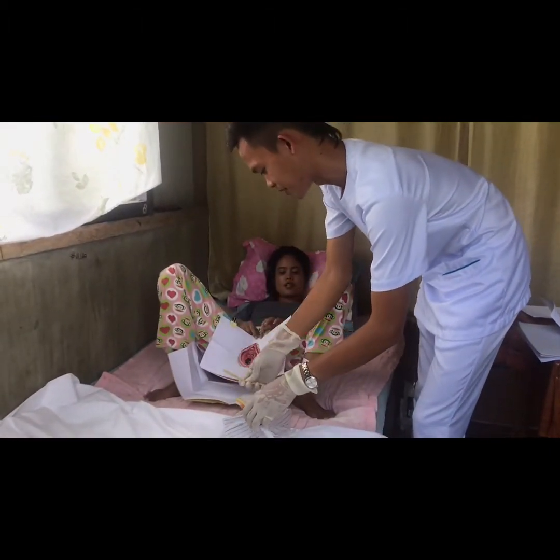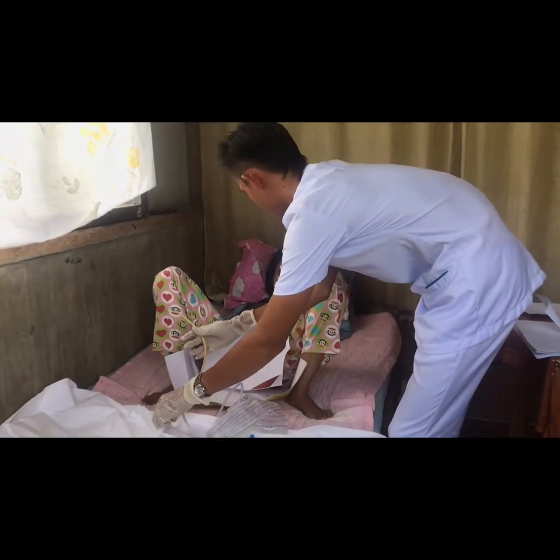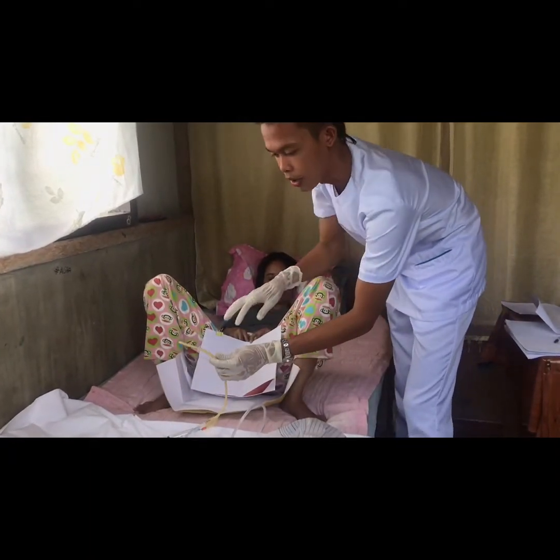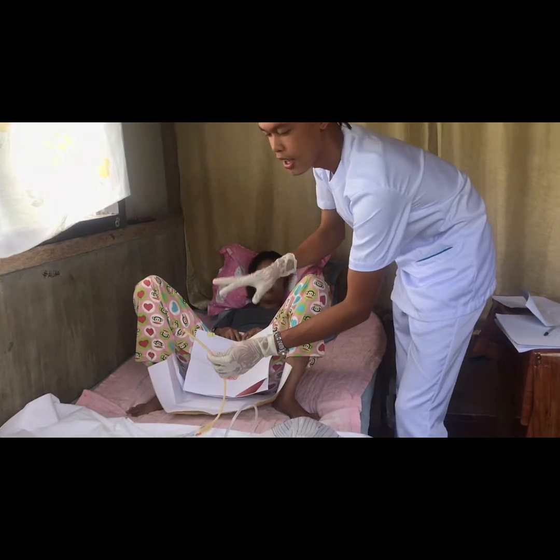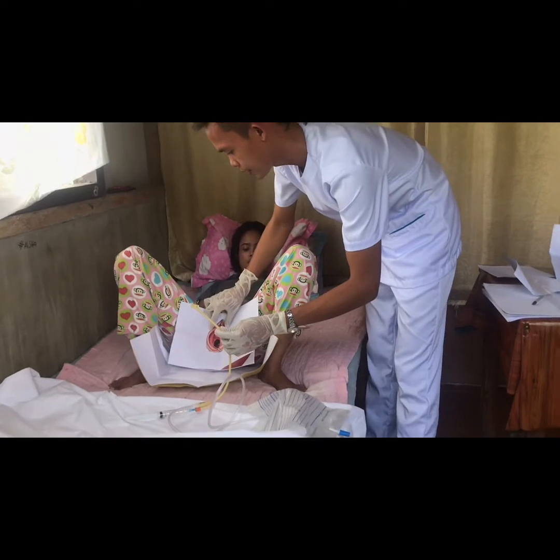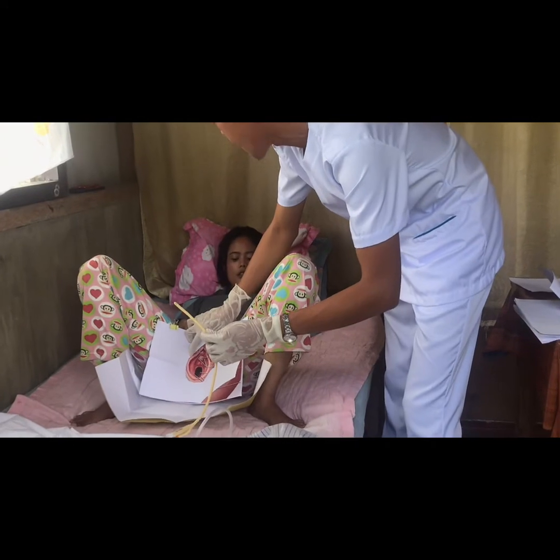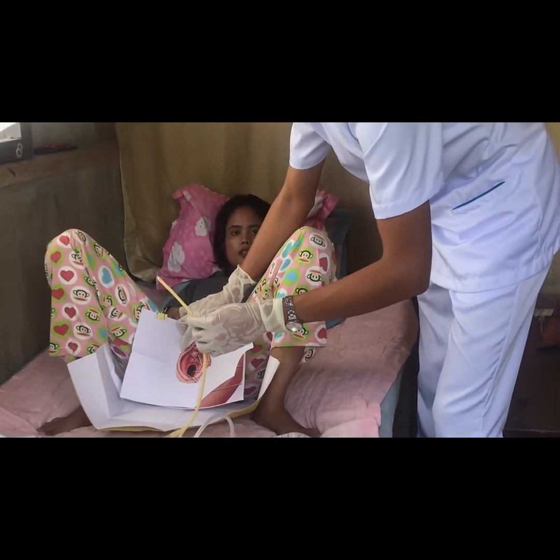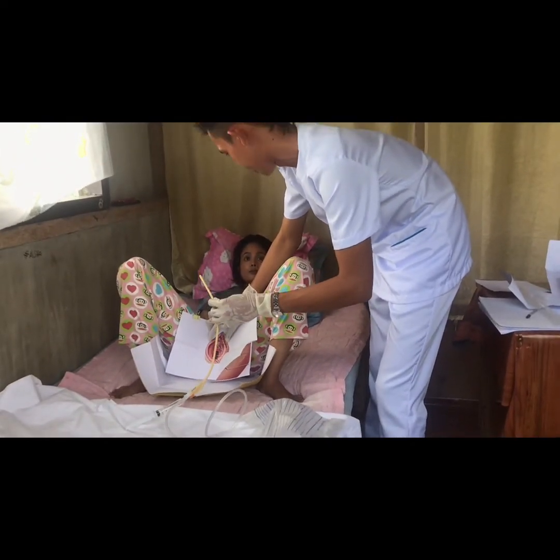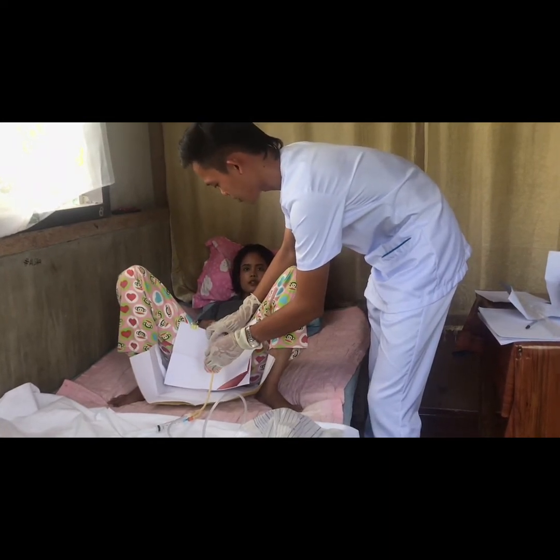So, ma'am, now we're going to insertion. Are you ready? Yes. Okay. All you have to do is to cooperate with me, okay? Okay. And everything goes well, okay? Okay. So for this time, I'm going to hold the catheter 2 to 3 inches long, and I'm going to spread the labia of the patient. Okay, ma'am, please help me. I'm going to insert it in 3, 2, 1, and please take a deep breath. Okay? If I say take a deep breath, you're going to do that. Okay? So we're now ready for insertion. Okay, please take a deep breath in 3, 2, 1.